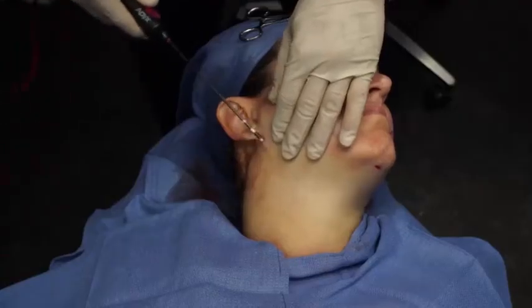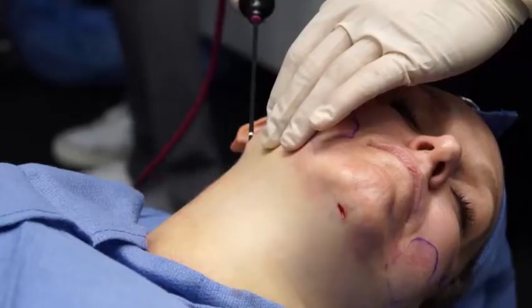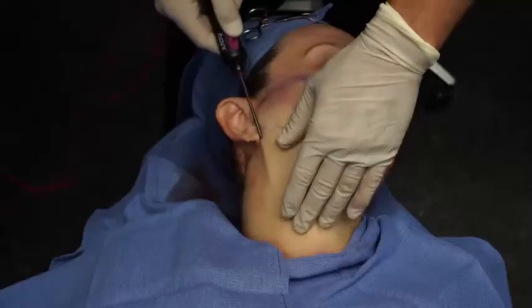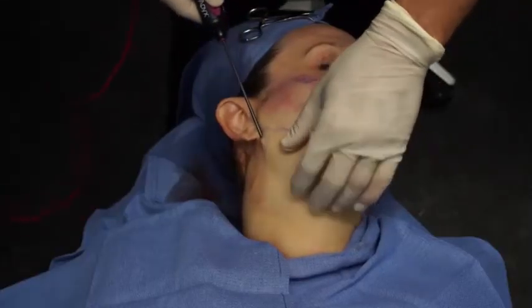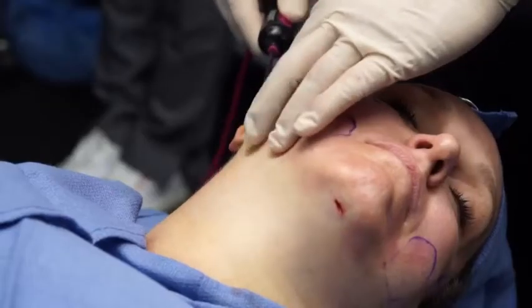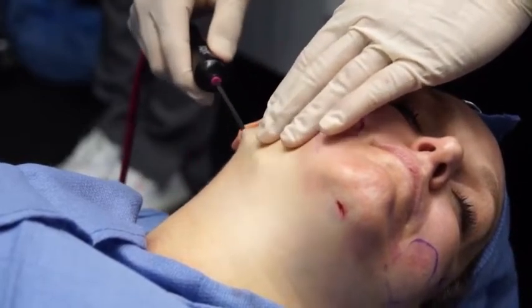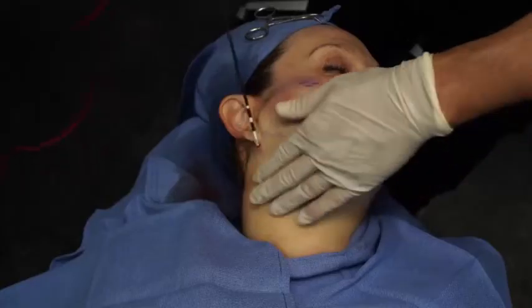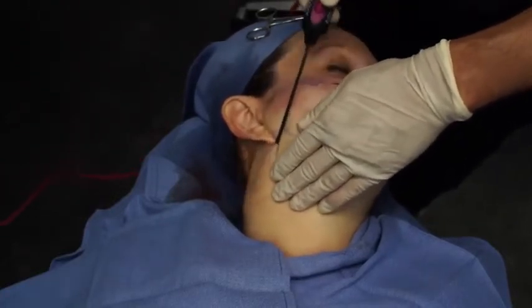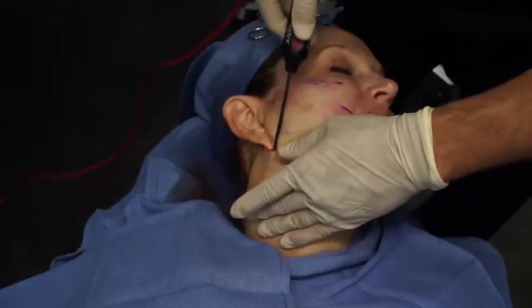Again, we're going to make sure that our insertion point has enough space for gas egress. We're going to activate proximally, and we notice that the gas is coming out. There's no emphysema. Now we can go ahead and safely introduce the handpiece and activate the handpiece in a retrograde fashion in our serial strokes right here, which create one pass. So in this case, we'll see that there is quite a bit of movement and space here, and so we'll treat overlying and posterior to the sternocleidomastoid.